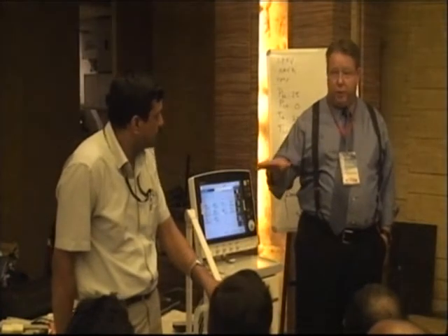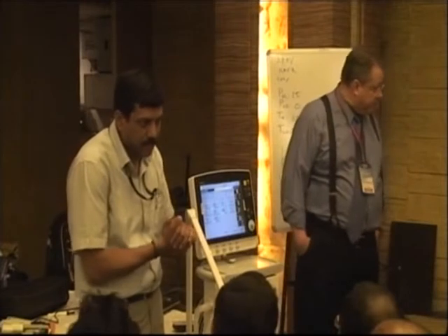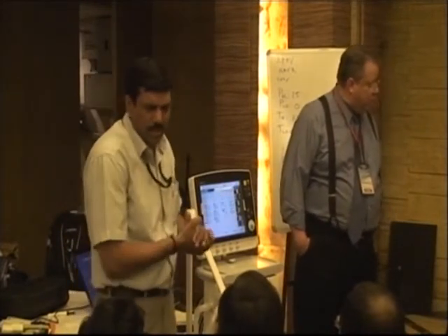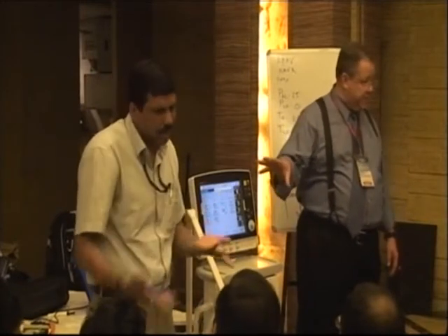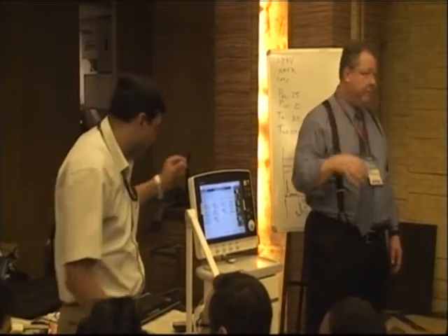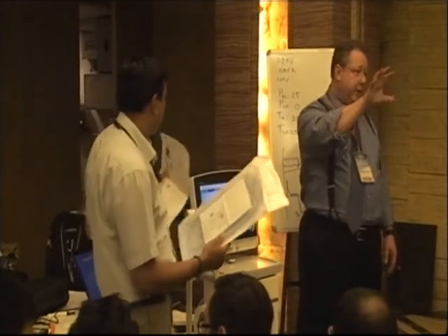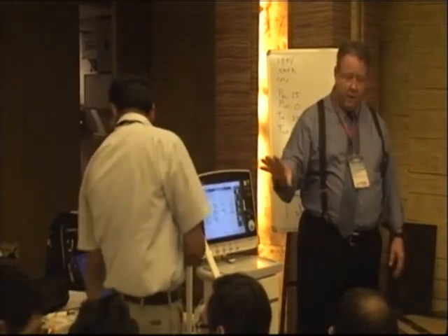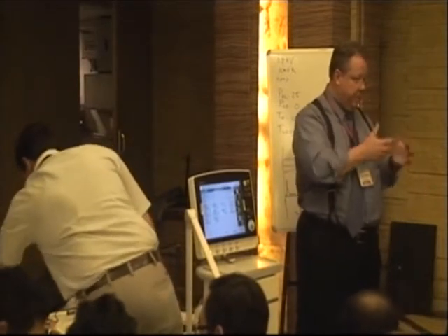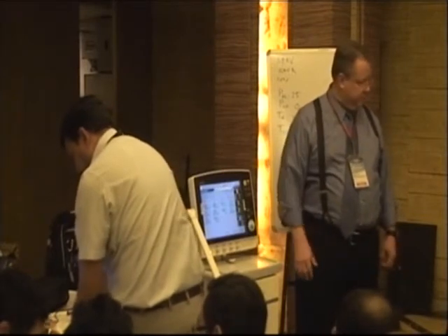If what you need to do is recruit, this is a good tool to do that. You have to keep the lung open. The nice thing about this is they can spontaneously breathe, whereas with the oscillator, spontaneous breathing will keep setting off the high pressure alarm. So most of the time our patients are actually paralyzed on the oscillator. Whereas here, there are some patients who even get to the point where they're falling asleep, or interacting and playing games, but still on this mode. So that's really the advantage.